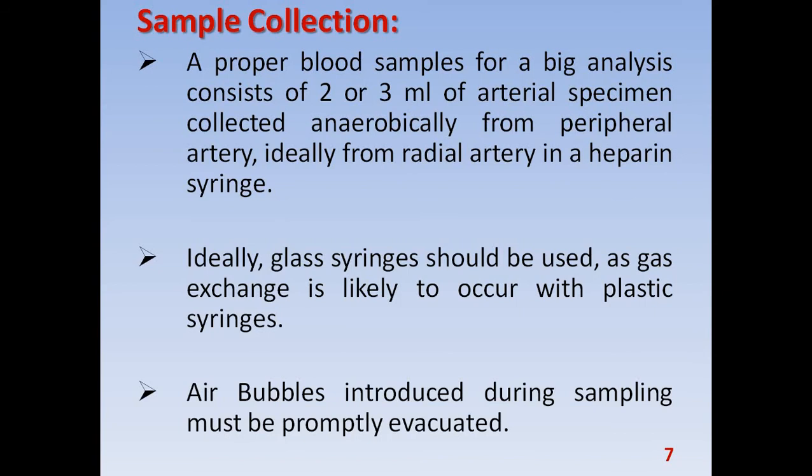Then after that we release the ulnar pressure while the radial pressure is maintained. Now while we release the ulnar pressure, the color should return from pallor to rubor. Rubor is the pinkish color, within 5 to 15 seconds. So that is the modified Allen's test. It is positive. That means the ulnar blood flow is intact and it's not compromised.